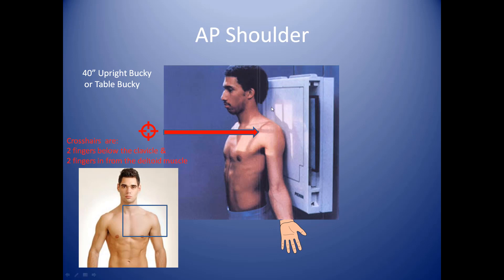As far as the bucky goes, you can see that the collimator light extends beyond the shoulder a little bit and matches with the cassette. The cassette has been pulled out just a little bit so you can see where it actually is. The camera tube is centered with the patient, with the bucky and the cassette, so everything looks well aligned. Your crosshairs are the only portion you need to pay specific attention to in this circumstance.